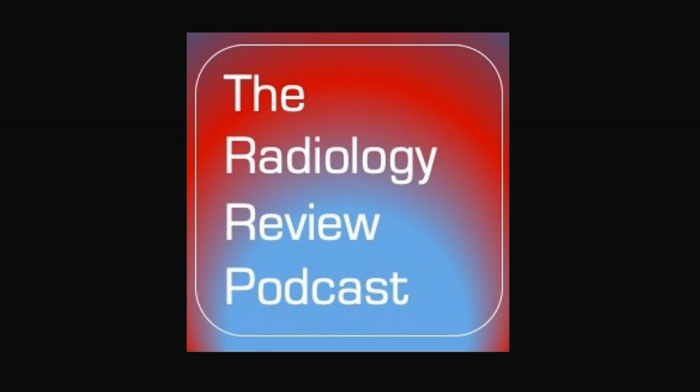thallium imaging. Next question. An infratentorial cystic lesion with an enhancing mural nodule is most classic for what entity in an adult and what entity in a child? The answer I am looking for is that an infratentorial cystic lesion with an enhancing mural nodule in an adult would be most common with hemangioblastoma.